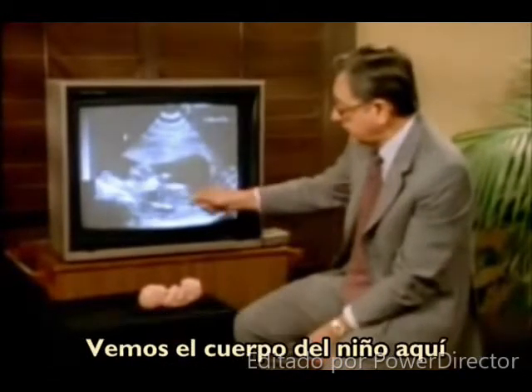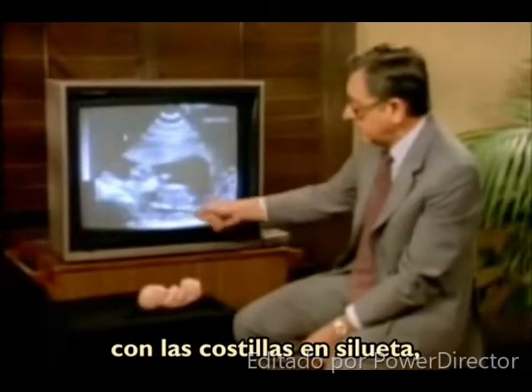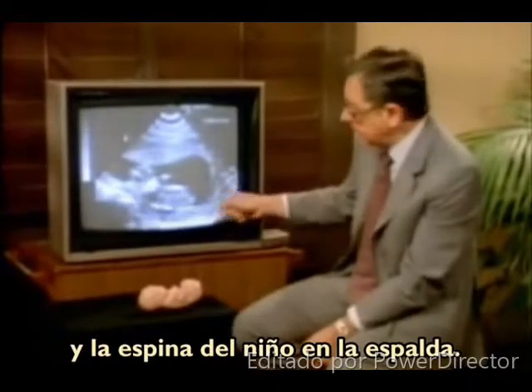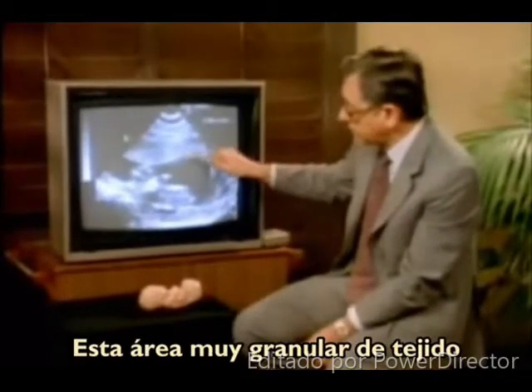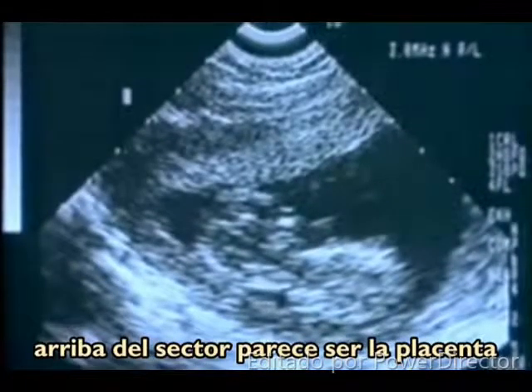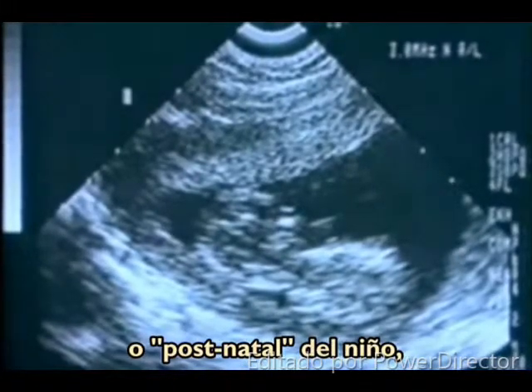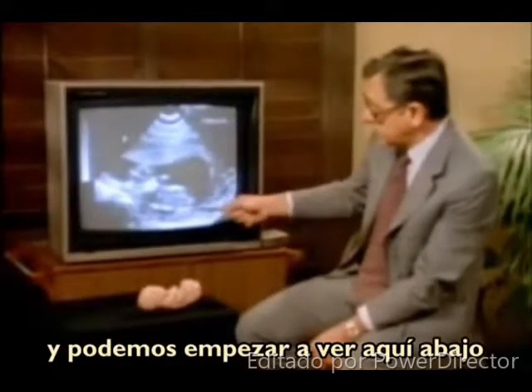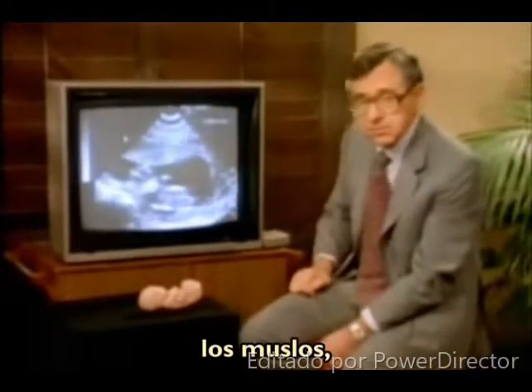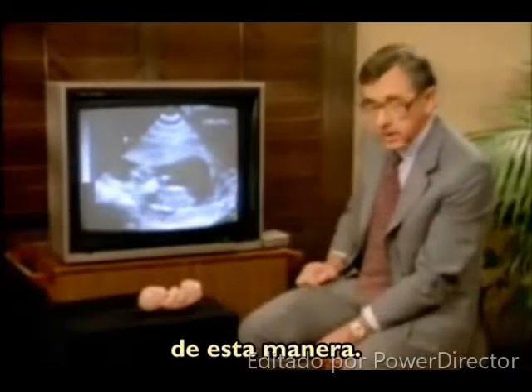We see the body of the child here with the ribs in silhouette and the spine of the child at the back. This rather granular area of tissue at the top of the sector appears to be the placenta, or afterbirth, of the child. And we can begin to see down here the thighs, the lower extremities of the child, coming off the body in this manner.